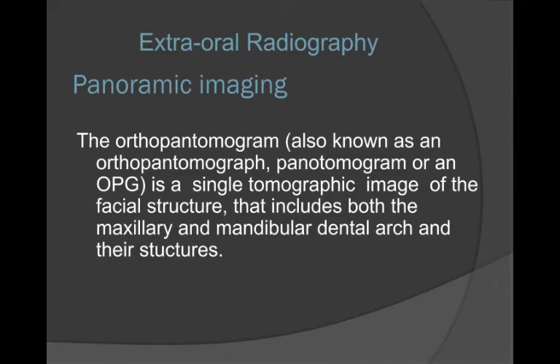Extraoral radiograph. We have panoramic imaging. Orthopantomogram, also known as orthopantomograph, pantomogram or OPG, is a single tomographic image of facial structures that includes both the maxillary and mandibular dental arches and their supporting structures.